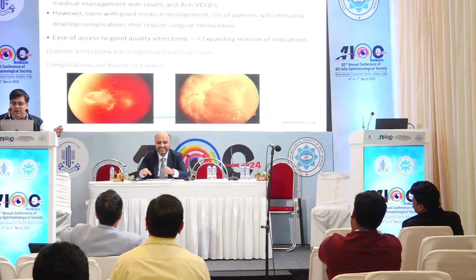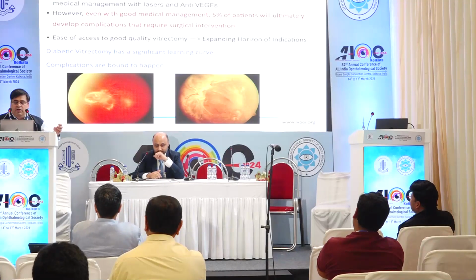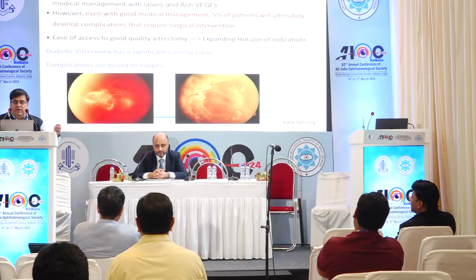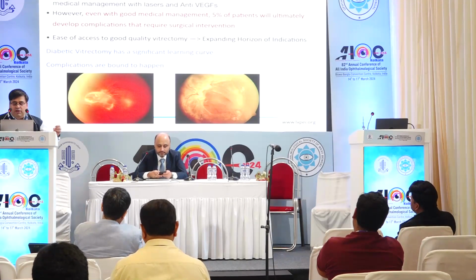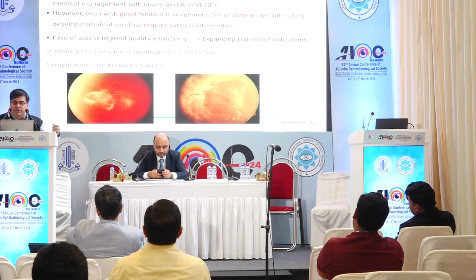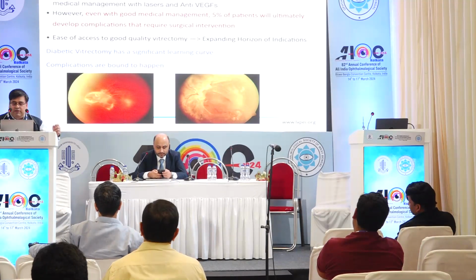Okay, so as we were talking about diabetic vitrectomy, the horizons have expanded a lot, and we go ahead with surgery in quite a few percentage of cases, but complications are a part of diabetic vitrectomy, especially as there is a significant learning curve involved, and 5% of patients, what has literature been saying, will ultimately develop some form of complication that may require surgical interventions.